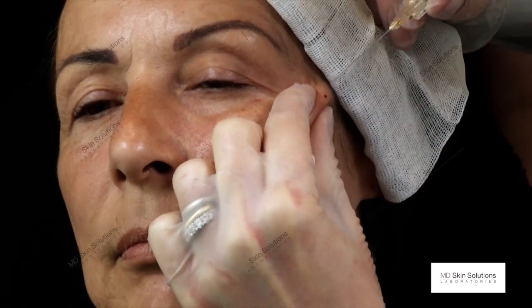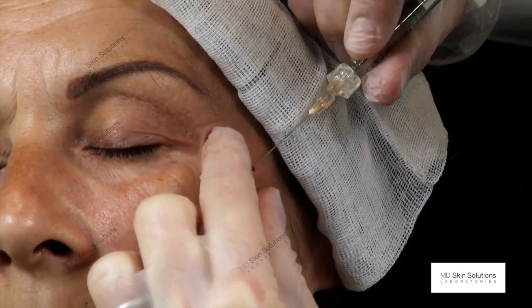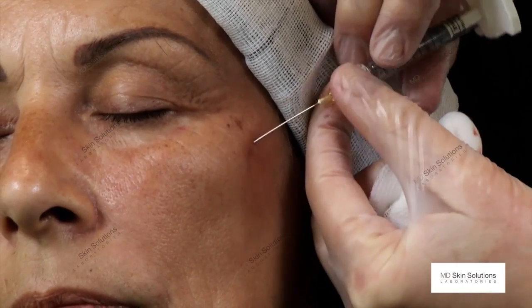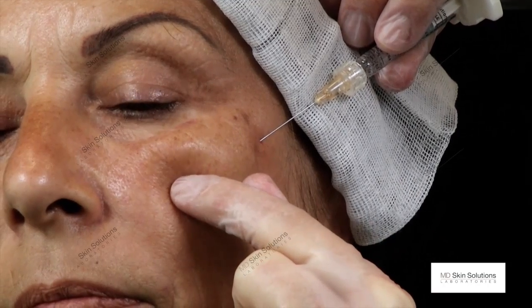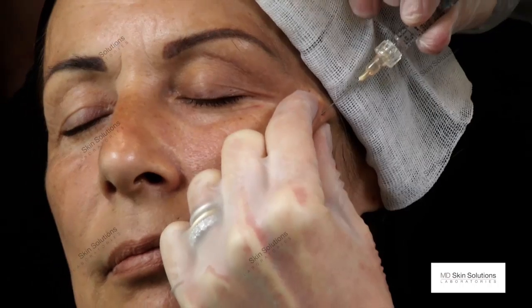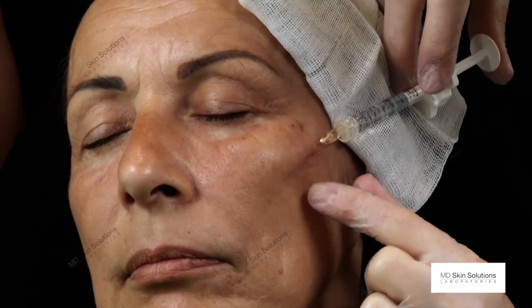I pinch the skin where I want to go deep, I insert the blunt tip gently, and now I advance the cannula in the direction of the cheek apex point, again by pinching the skin, pointing down to the bone and advancing gently.